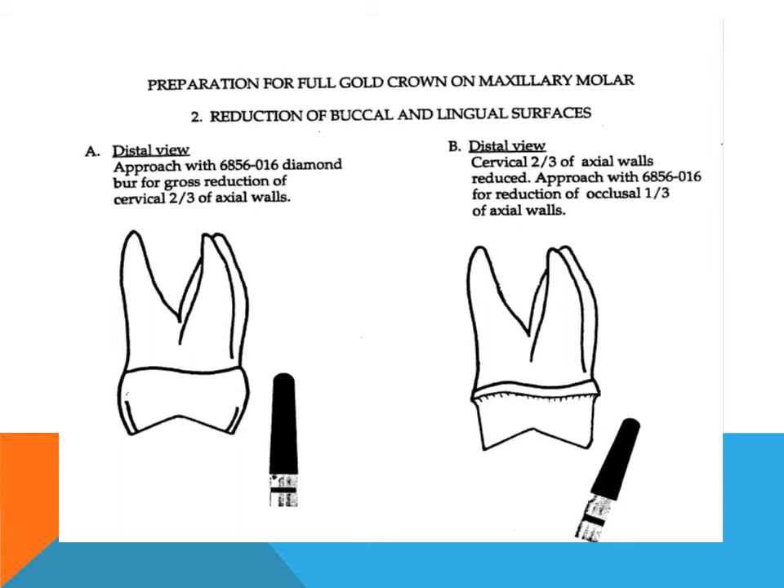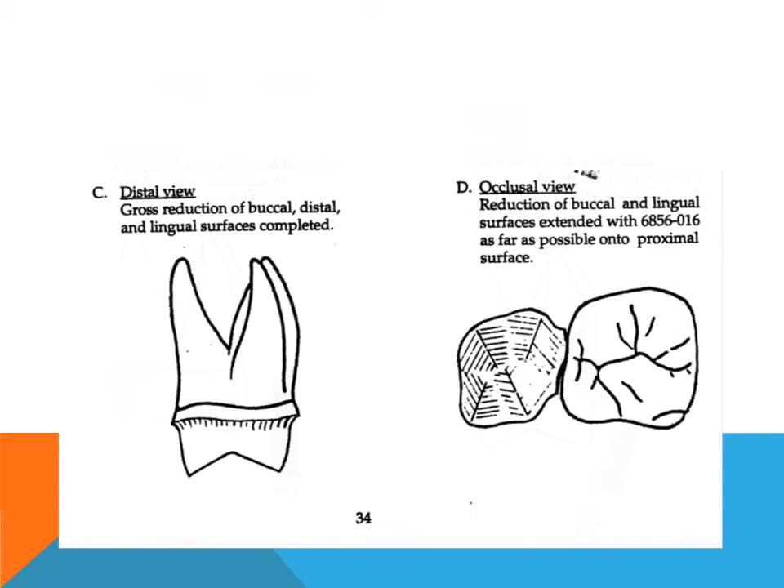When the cervical two-thirds of the buccal and lingual surfaces have been reduced sufficiently with the diamond burr, the stone is slanted slightly according to the curvature of the tooth surface for the reduction of the occlusal one-third of the axial surfaces. Sufficient tooth structure must be removed to assure a minimum of 0.5 mm clearance for gold coverage, without overtapering the axial walls.